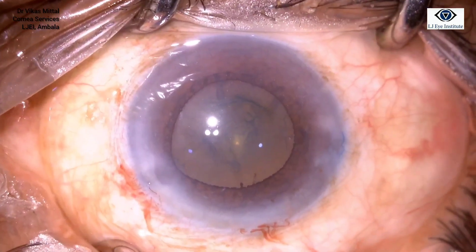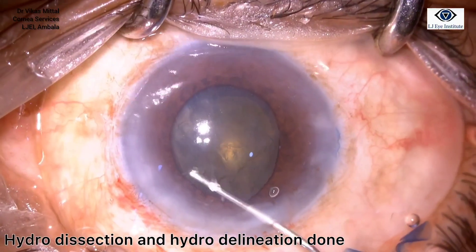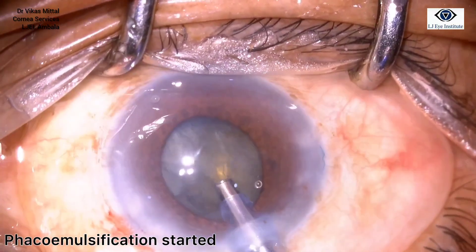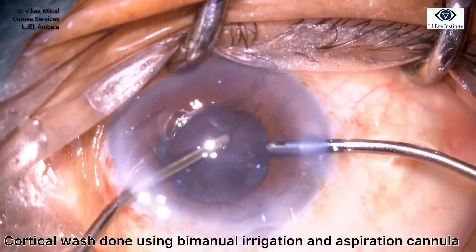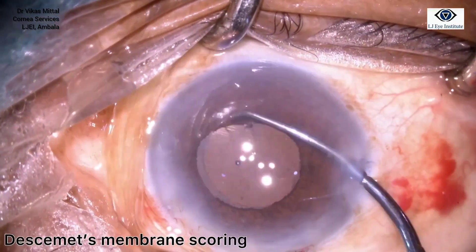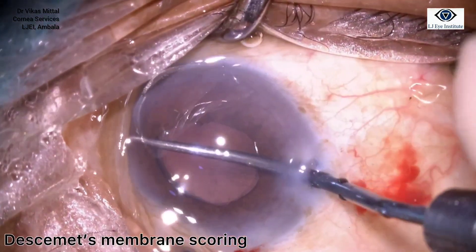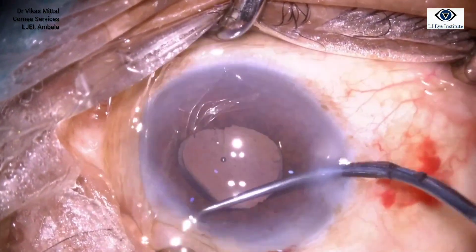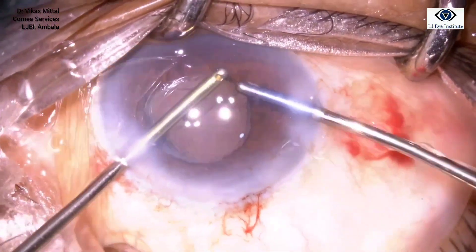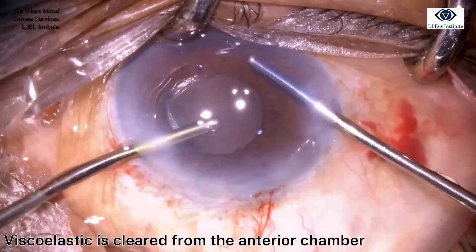As the anterior chamber appears clean, we proceed with our routine phacoemulsification surgery. A foldable IOL is implanted in the bag. We then checked for any Descemet's membrane remnants and found none, indicating that the entire DM was scraped off earlier during desmetorexis along with the deposits. All viscoelastic substance was cleared from the anterior chamber before placing the graft.